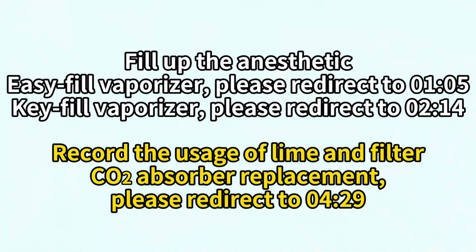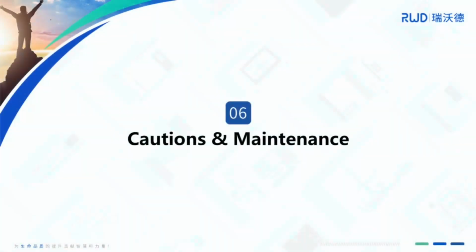Please fill up the anesthetic on time. For easy fill vaporizer, please redirect to 1 minute and 5 seconds. For key fill vaporizer, please redirect to 2 minutes and 14 seconds. Please redirect to 4 minutes and 29 seconds to change the carbon dioxide absorber.